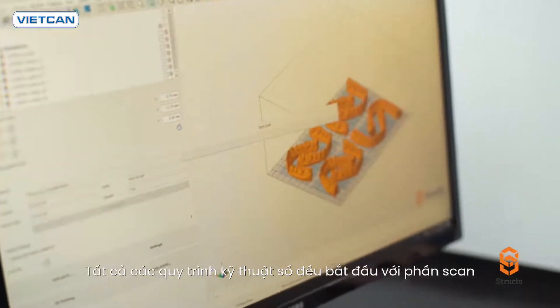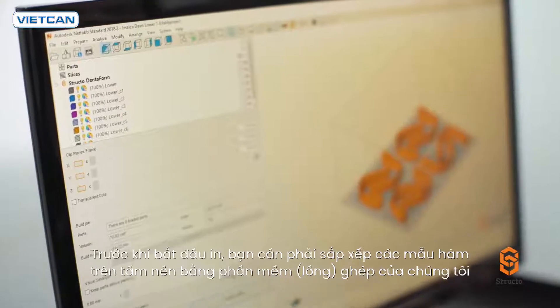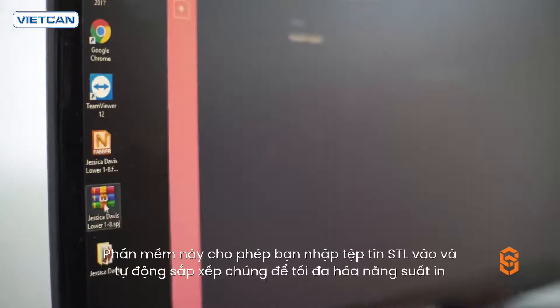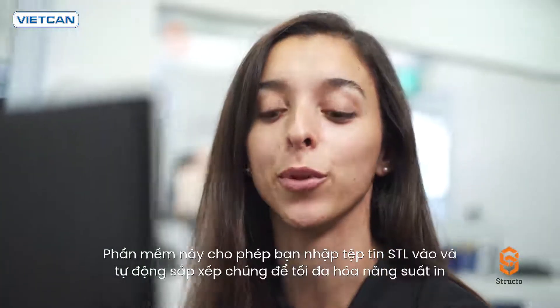All digital workflows begin with a scan. Here, I have a couple of STL files. Before the printing takes place, you will need to arrange the models on the platform using our nesting software. This software allows you to import your STL files and automatically arrange them to maximize your throughput.